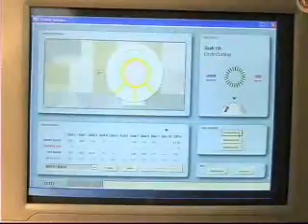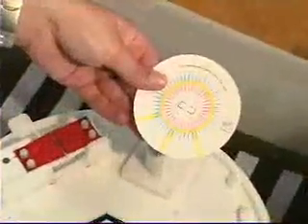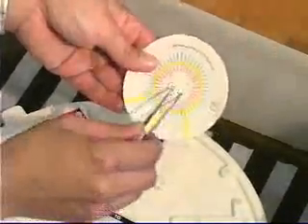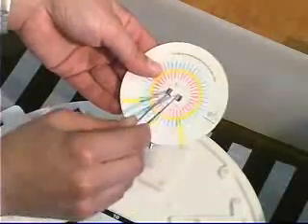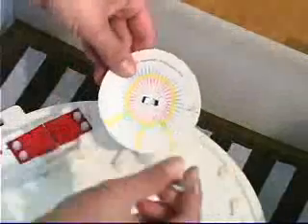Task 10, the final task, involves precise cutting of a circular pattern delineated by the yellow line. Instruments include 1 forceps and 5 millimeter laparoscopic scissors. The paper disc has 2 tabs in the center which must be lifted. It also has 3 perforations which fit into the pins on the pod.